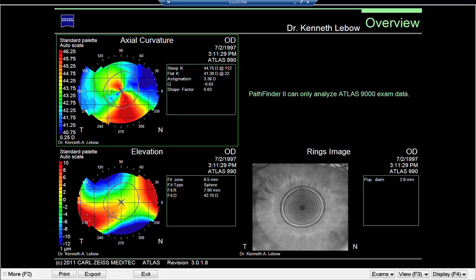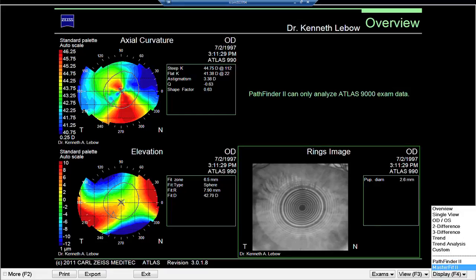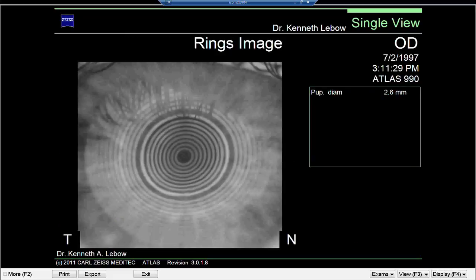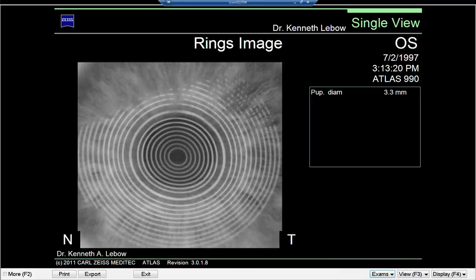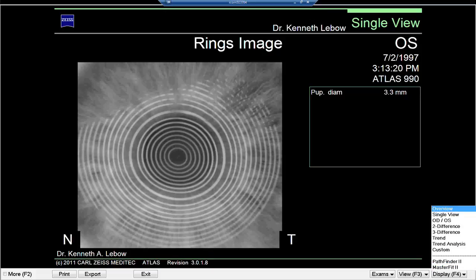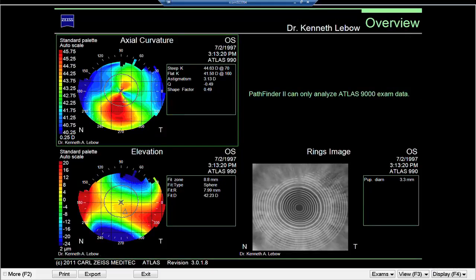Looking at the ring image, the rings are slightly slanted but they're full and complete — so there's really not any suspicion of keratoconus based on that ring image. Looking at the left eye, the rings are nice, clear, sharp, and crisp. Going back to the overview map, everything looks pretty normal. The shape factor was only 0.49, below the threshold of 0.6. The patient was satisfied with their improvement in vision, and we sent him off to college.